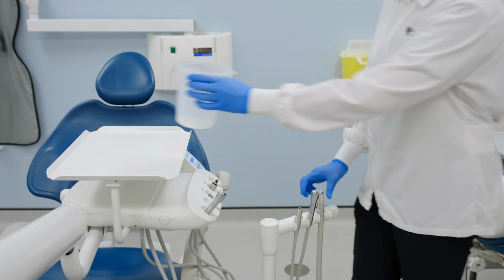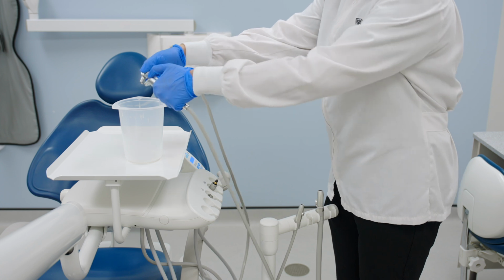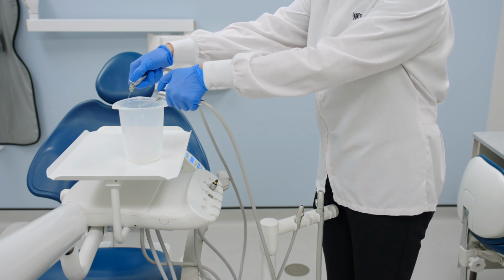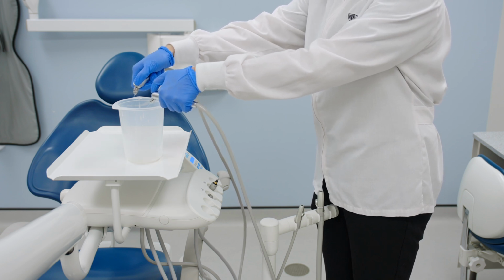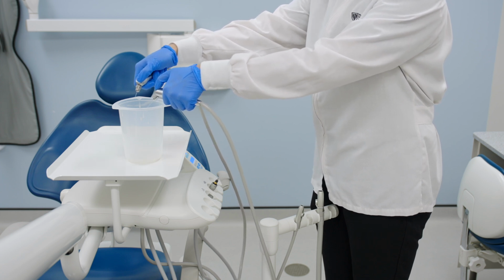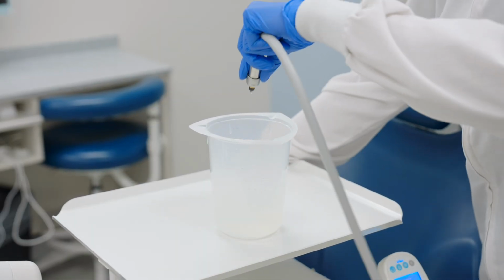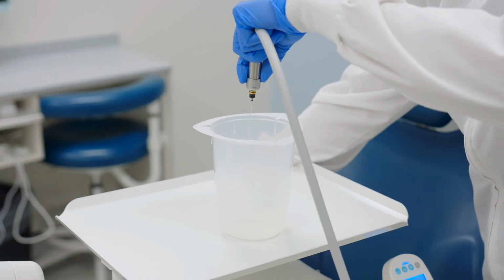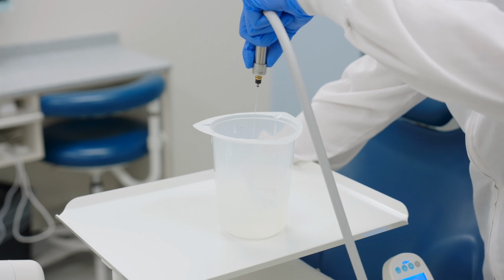Using the empty beaker, the dental unit water line will be flushed. Before the first patient of the day is seen, the lines, operator and assistant side air water syringe tips, and the high-speed tubing are to be run for 3 minutes. Pick up both air water syringe tips and expel water from the tips for 3 minutes into the clear plastic beaker. Next, pick up the high-speed line. Place the line into the beaker and using the flush switch located at the back of the unit, expel water from this line, again for 3 minutes.